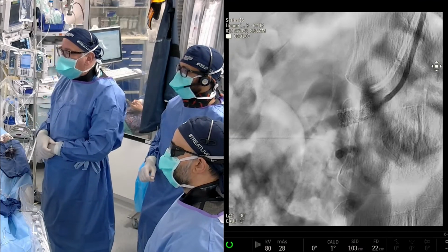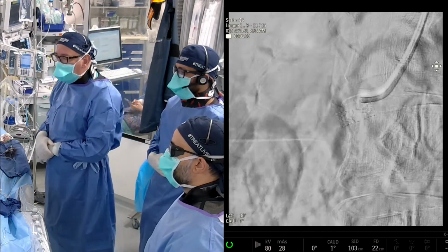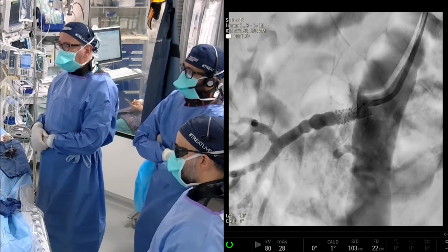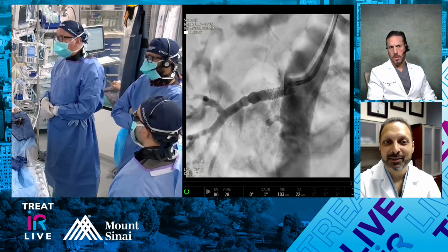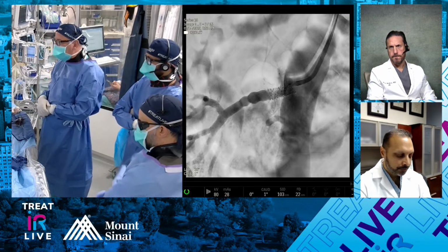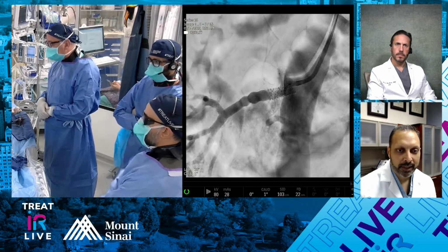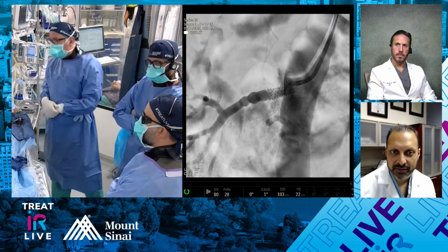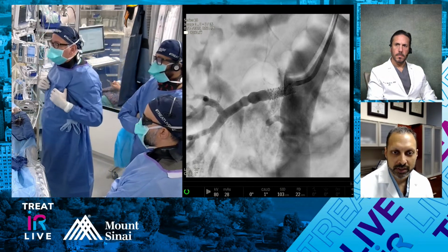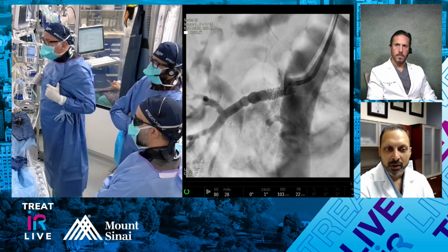I was going to ask you, Parag, if you measured the normal artery at 5 millimeters, what kind of implant would you put in? So did you measure it at 5? Yes, we measured the artery distal to the stenosis at about 5 millimeters. Not bigger, just at 5. I guess the 5's fine. I think, if it was a little over 5, I would have gone with the 6, with light inflation, but I think 5 is the smallest I'll go.